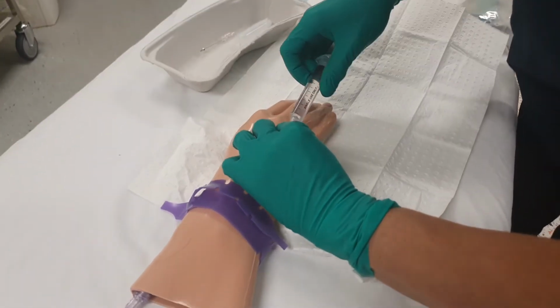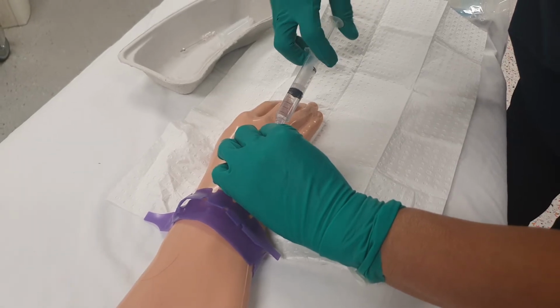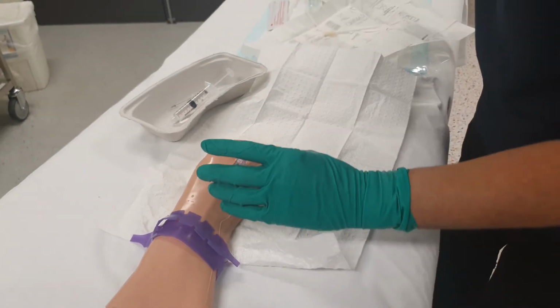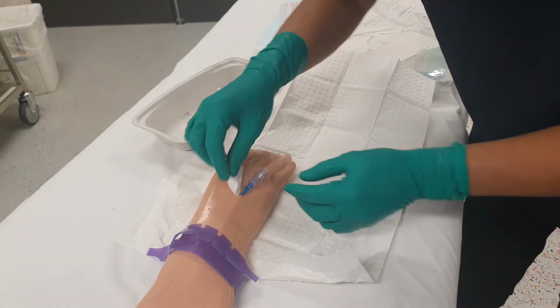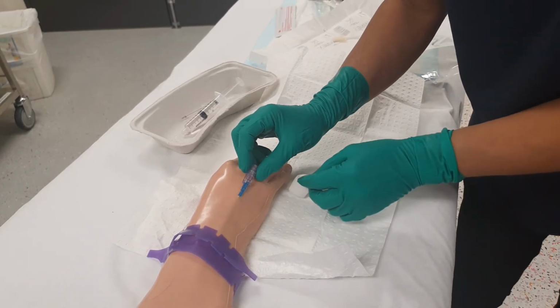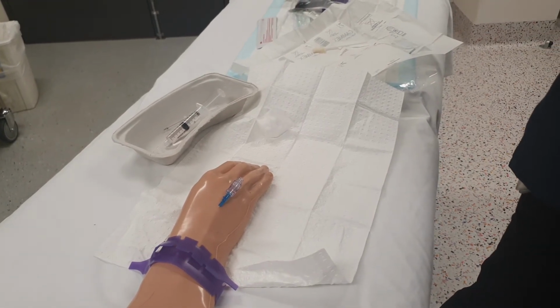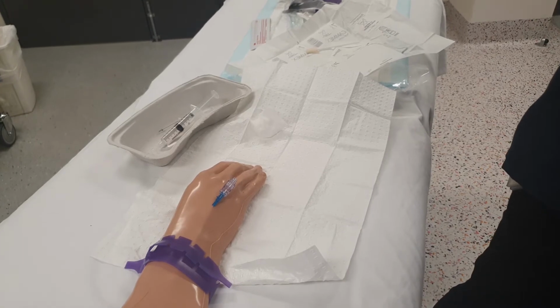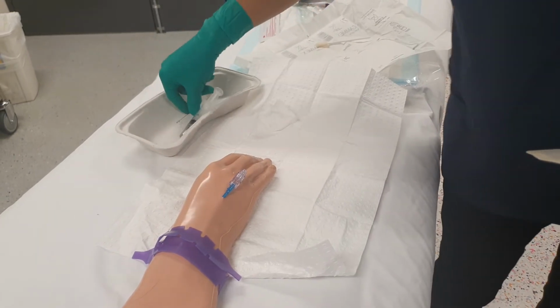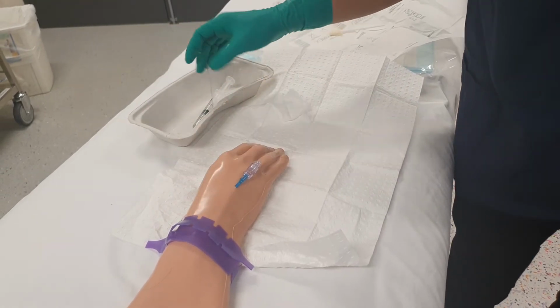Okay, so I can flush. You don't have to use the full 10. And now we've got to dress the cannula site. So get rid of the excess blood, because the excess blood is going to attract bacteria. Okay, so that Steri Strip doesn't go across the cannula because it's too fat, and it's really important that we see the entry site. Any signs of extravasation or any phlebitis is going to show up at the entry site.